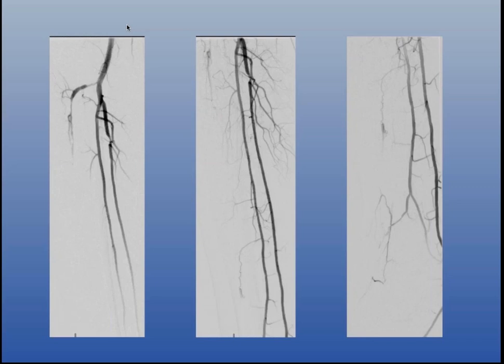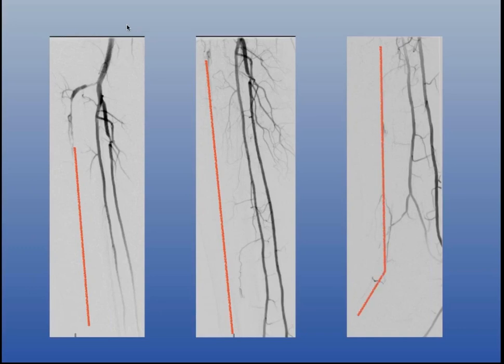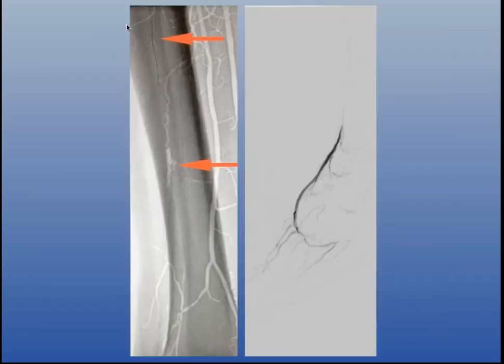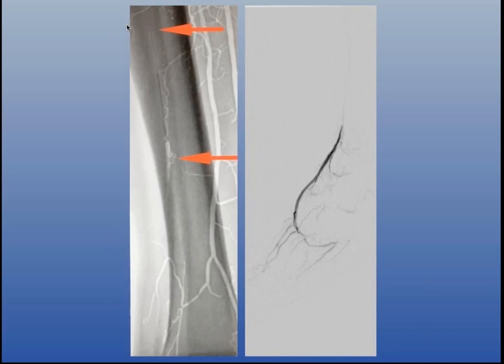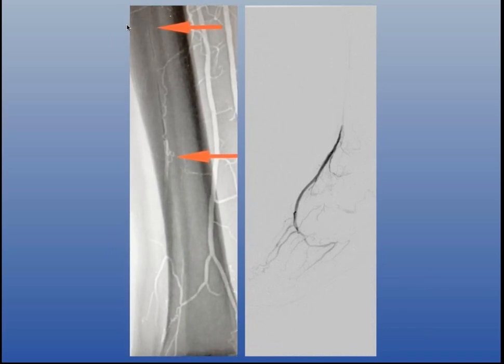And basically my path is I want to recanalize the AT and then eventually get to the pedal loop, assuming that it's not hibernating, and I have a shot at doing a successful recanalization. So if you look at this guide wire now, again, I have a guide wire with a relatively high tip load, and I'm using a penetration technique because I'm rotating it back and forth.